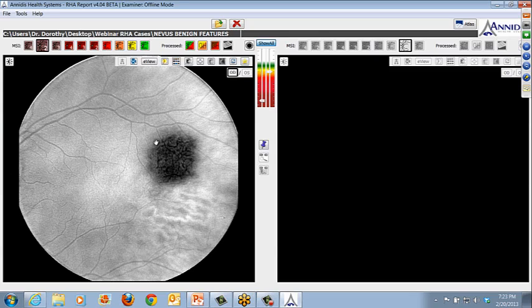Yes. And I know that it's not going to be the same at each level. Looking at a patient who has regular traditional fundus photography, we're only seeing what's projected through, and so we're not seeing that exact detail. At least with this, we can get that detail at those different levels. Right, and I actually agree with that.